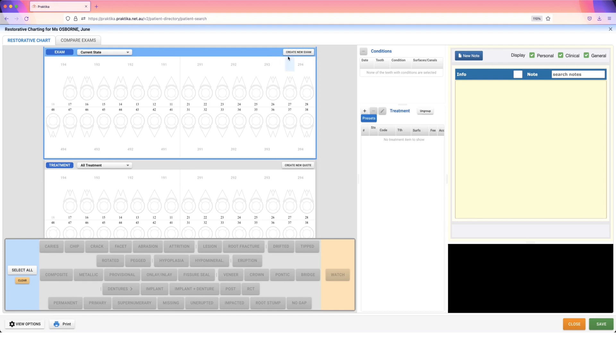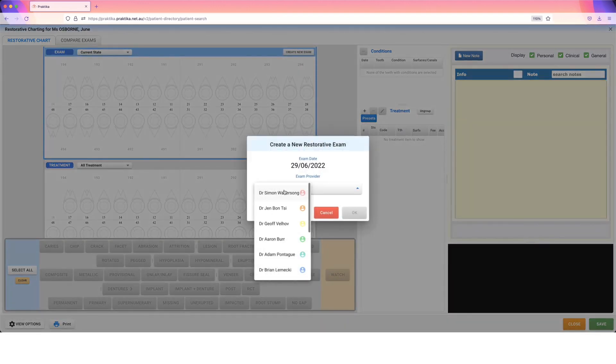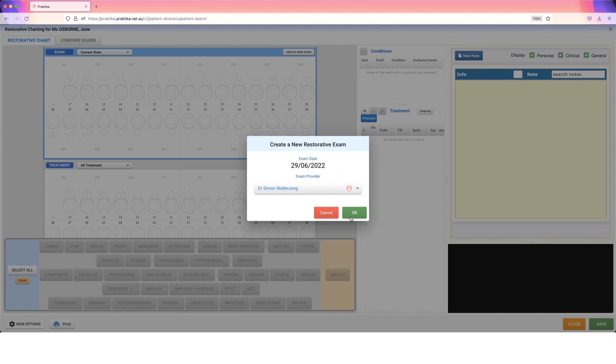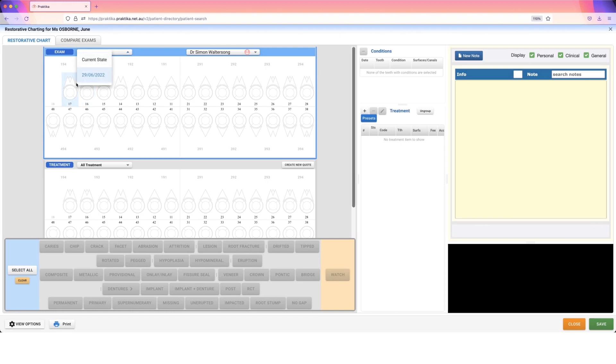So if I click on create a new exam, I can select the provider. Let's say Simon's doing that one today. The benefit of this now is I've got a dated examination and I can repeat this process in six months or 12 months whenever they're coming back in to have that recall done. I can do a new examination and then it's really easy for me to compare when changes have happened.